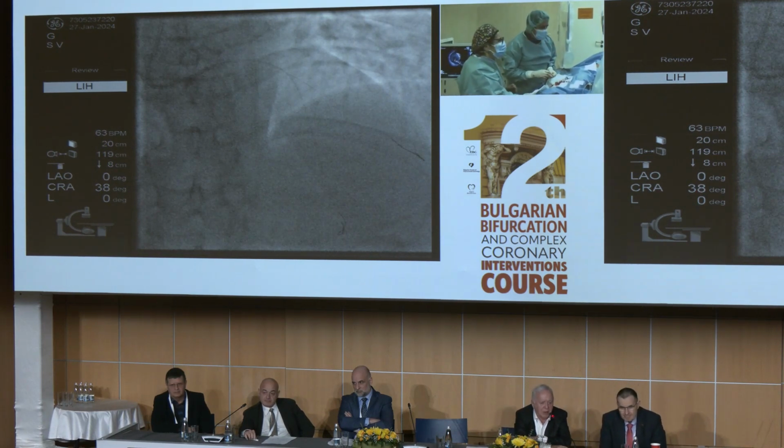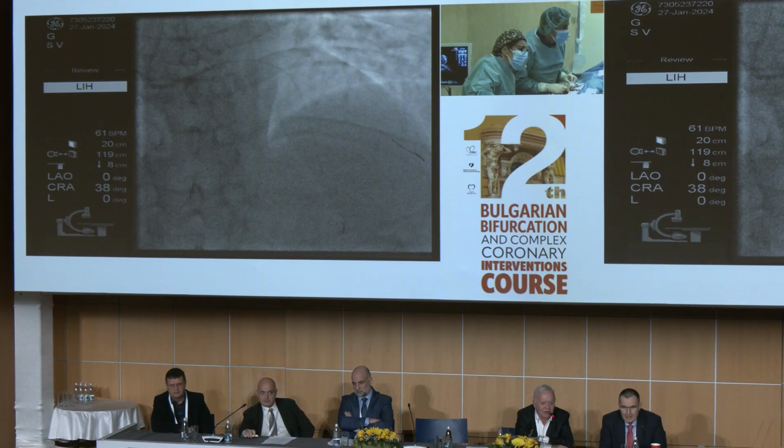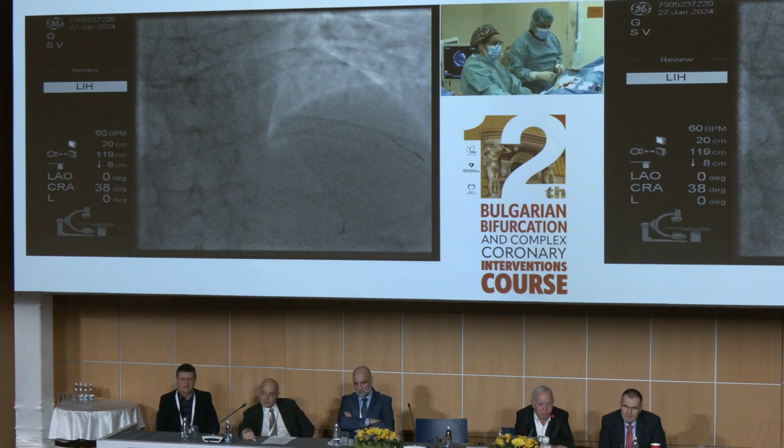Will you pre-dilate or not? No, we will try to do direct stenting. We feel confident. Which stent are you choosing?